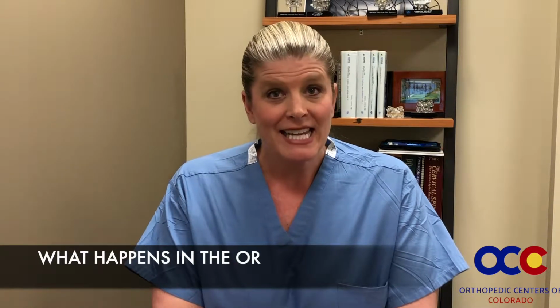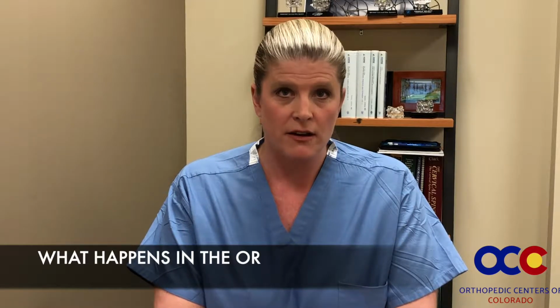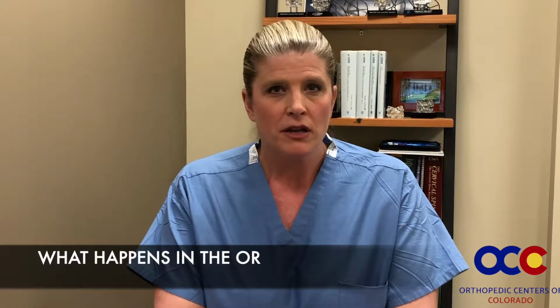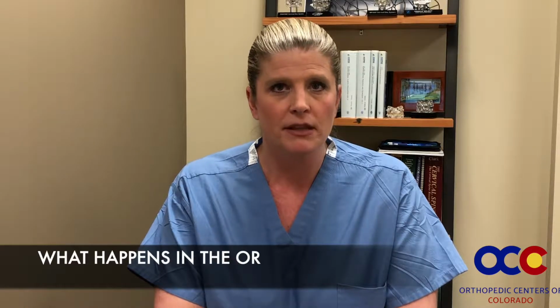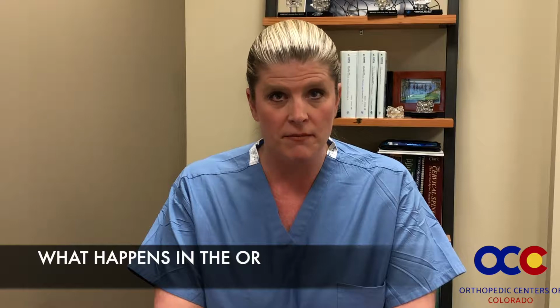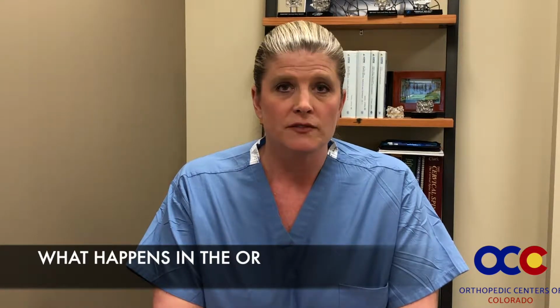As far as what happens in the operating room, you've probably already watched the procedure video, so you're a bit aware of that. But this is going to be a little bit of a recap of the surgery as well as some commonly asked questions that people typically have. The procedure itself is done under general anesthesia. We also have people in there monitoring your spinal cord and spinal nerves during surgery.